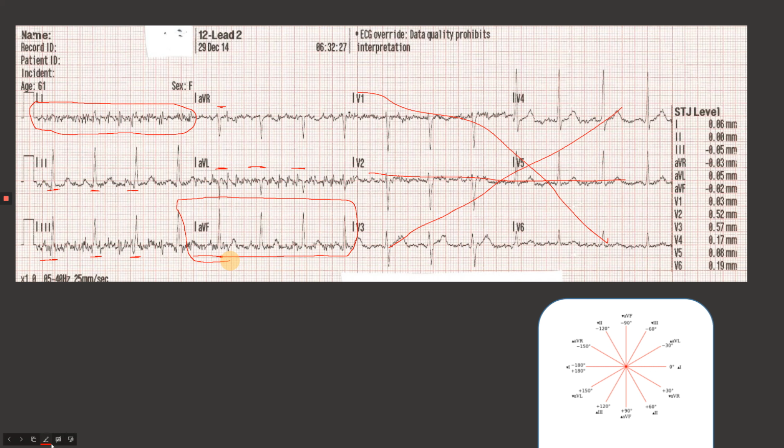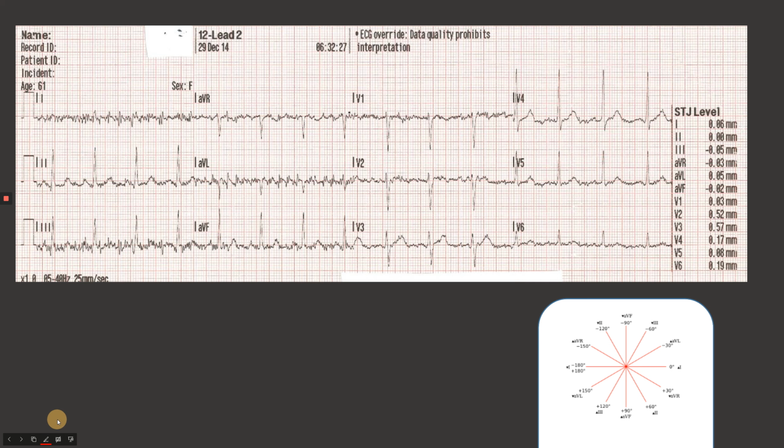And I will point out one other thing too, especially with this one. You'll notice here, if I am looking at lead 1 to try to interpret anything, it's pretty much a wash. It's too much artifact. I can't see any distinguishing waves really. It's just kind of garbled junk. One pro tip though, if you are trying to determine where the QRSs or P waves are, on the LifePak 15 at least, each column is one moment in time.